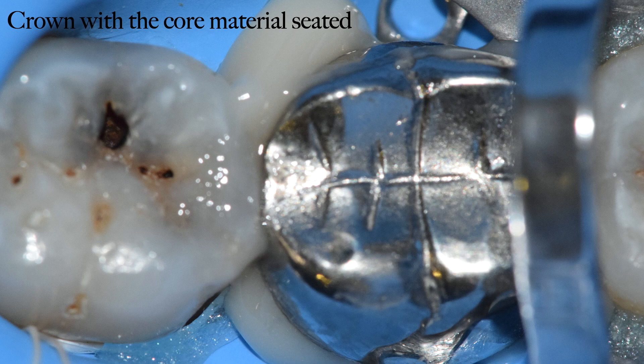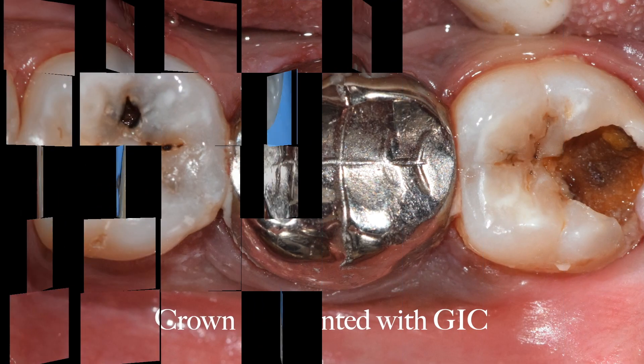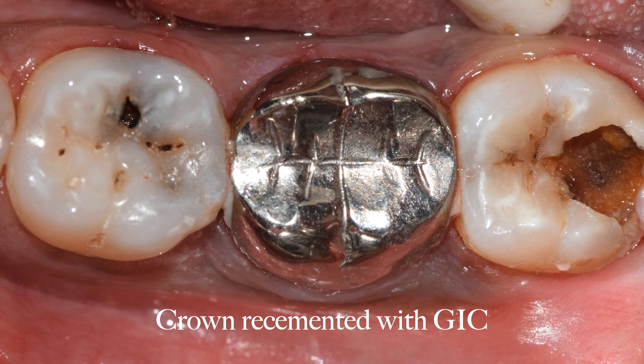It is mandatory that for such cases you always use a dual cure core material, because there is no possibility that light is going to pass through the metal crown and cure the core material inside. Once this is done, the metal crown is removed, whatever excess flash is removed, and now we have our new tooth core ready which is completely caries free. We then go ahead and fit the same old crown with glass ionomer cement — this is how we save the patient from the extra monetary steps of fabricating a new crown.